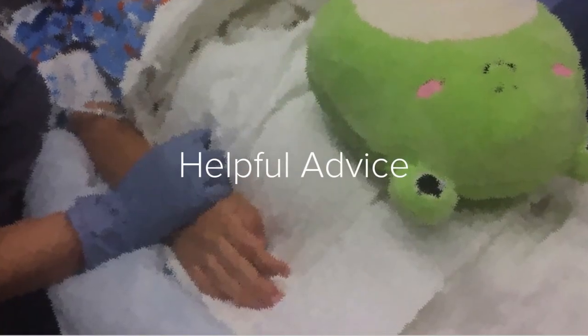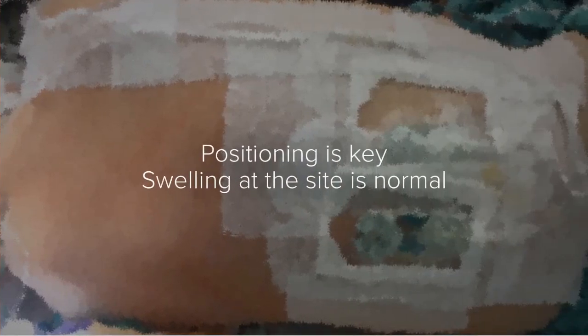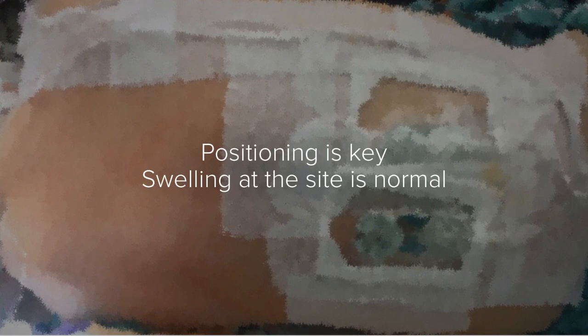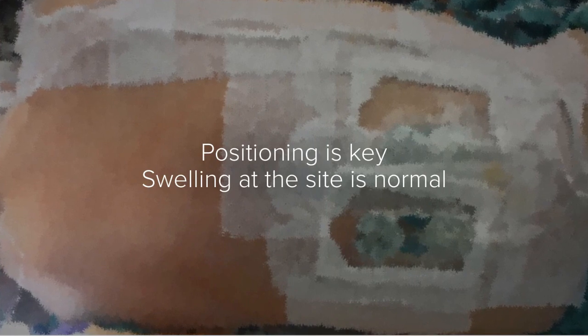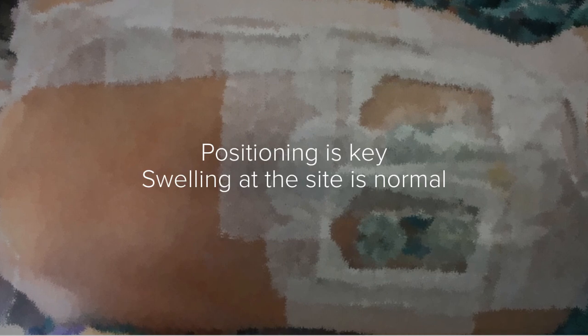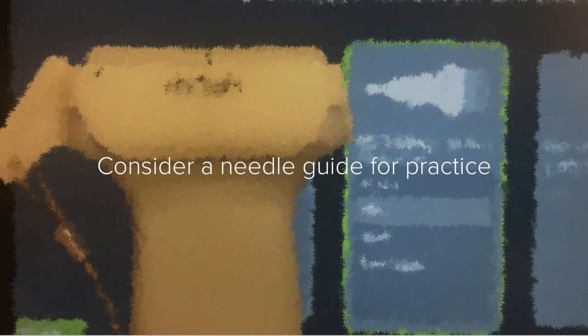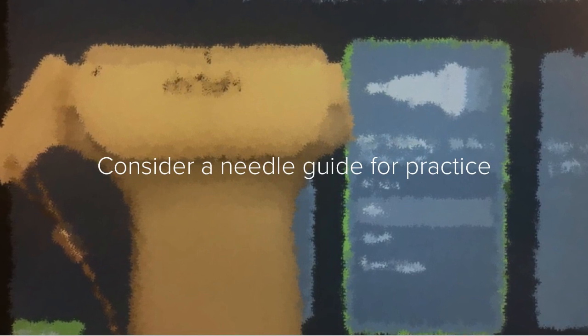Here is some helpful advice from experienced practitioners. Stable positioning is key to help ESP placement. Swelling at the site is normal due to the volumes given. When starting, consider a needle guide for practice and speed.